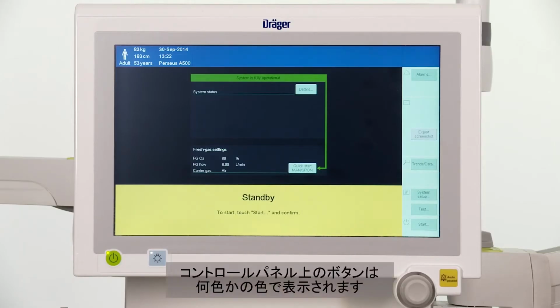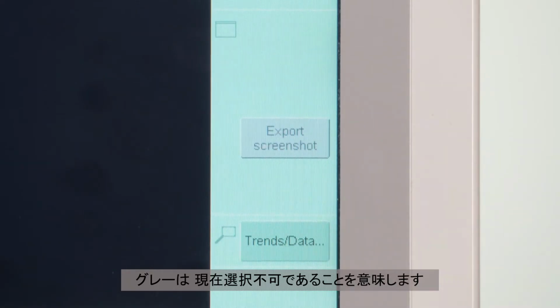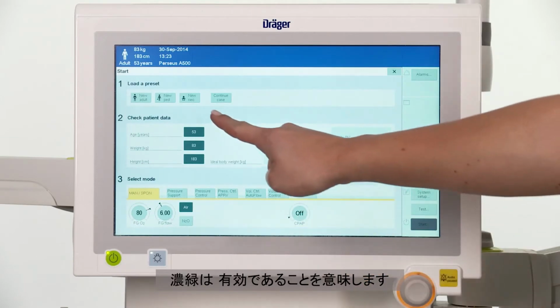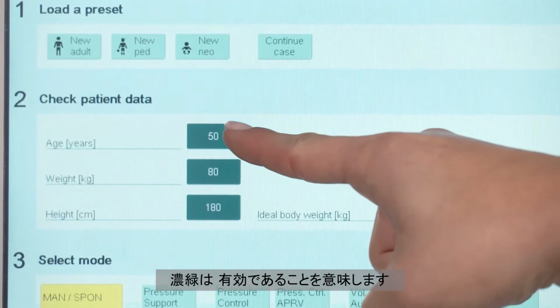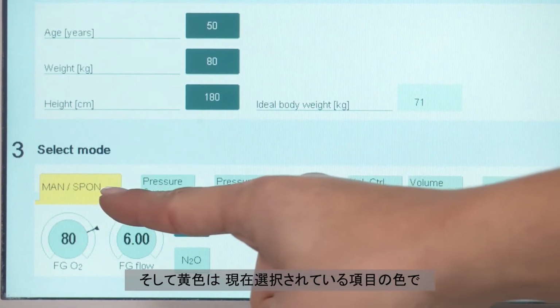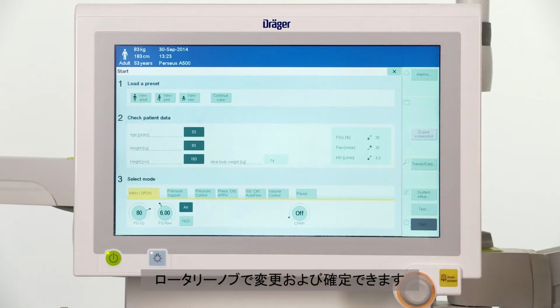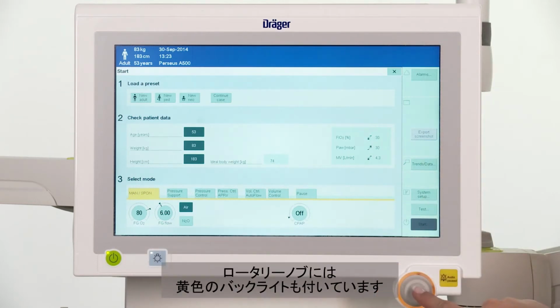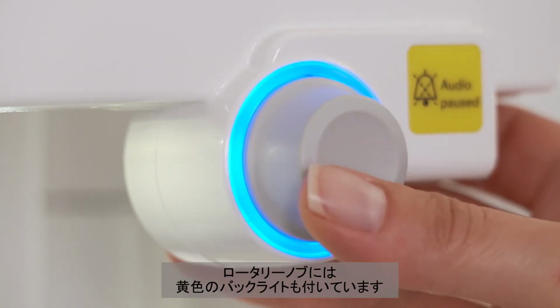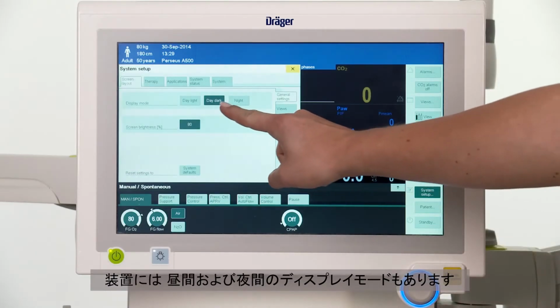The buttons on the control panel can be displayed in different colours. Grey means currently not selectable. Dark green means active, while light green is selectable but not active. Yellow is the colour for the currently selected element, which can be changed and acknowledged using the rotary knob. The rotary knob is also backlit in yellow. The device also has a night and day display mode.